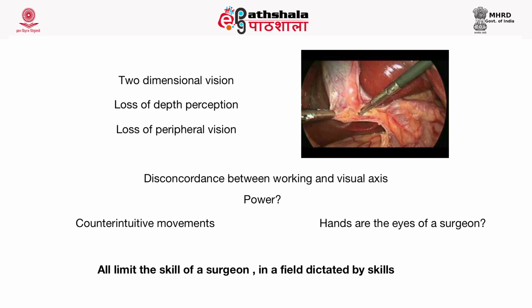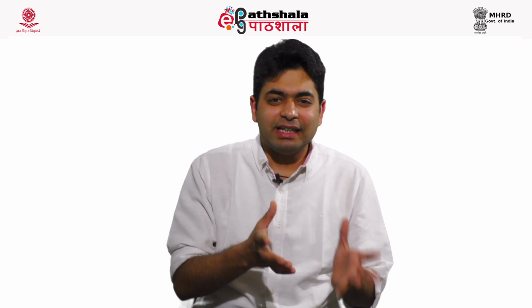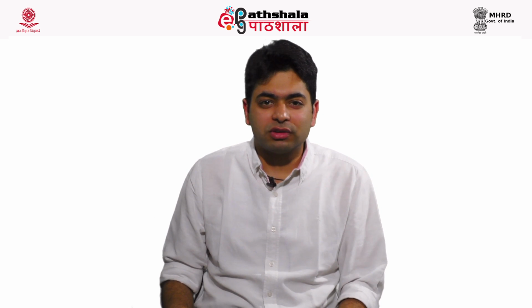Also, in open surgeries we used to use our hands, and in those instruments, we used to have a fulcrum effect where we can apply a lot of power. But in a laparoscopic instrument, the grabbing arm is very small and located at the distal tip of the instrument, and the handles are located at the other end. So there is discordance between the power that we are applying and the power which is exhibited at the instrument end. Also, we used to say that hands are the eyes of a surgeon. Especially in these cases, that saying does not remain true.